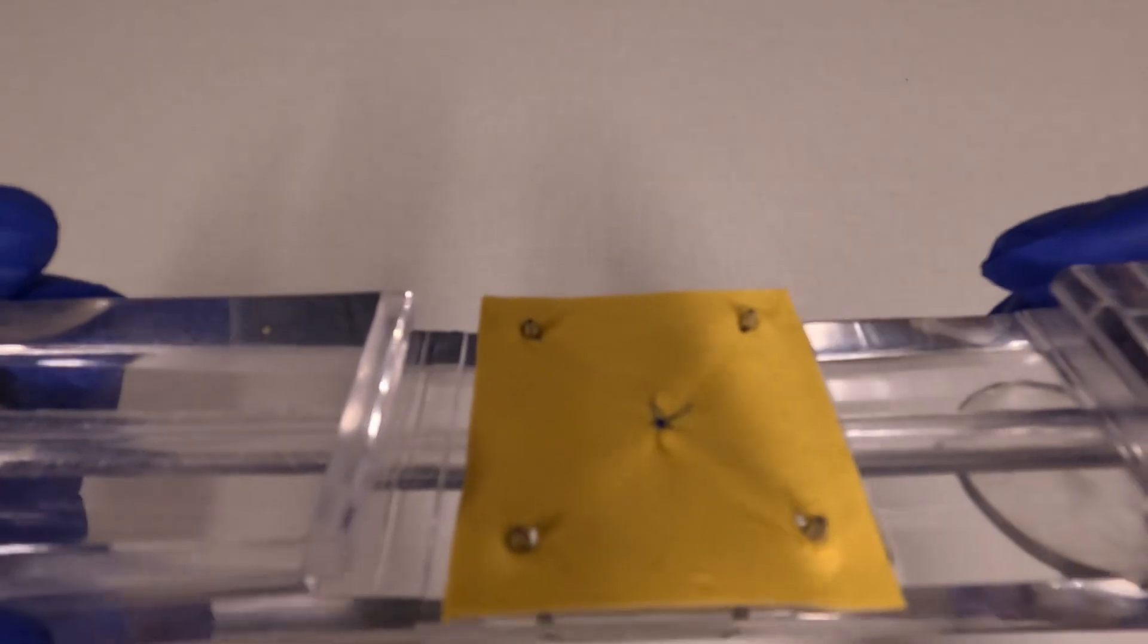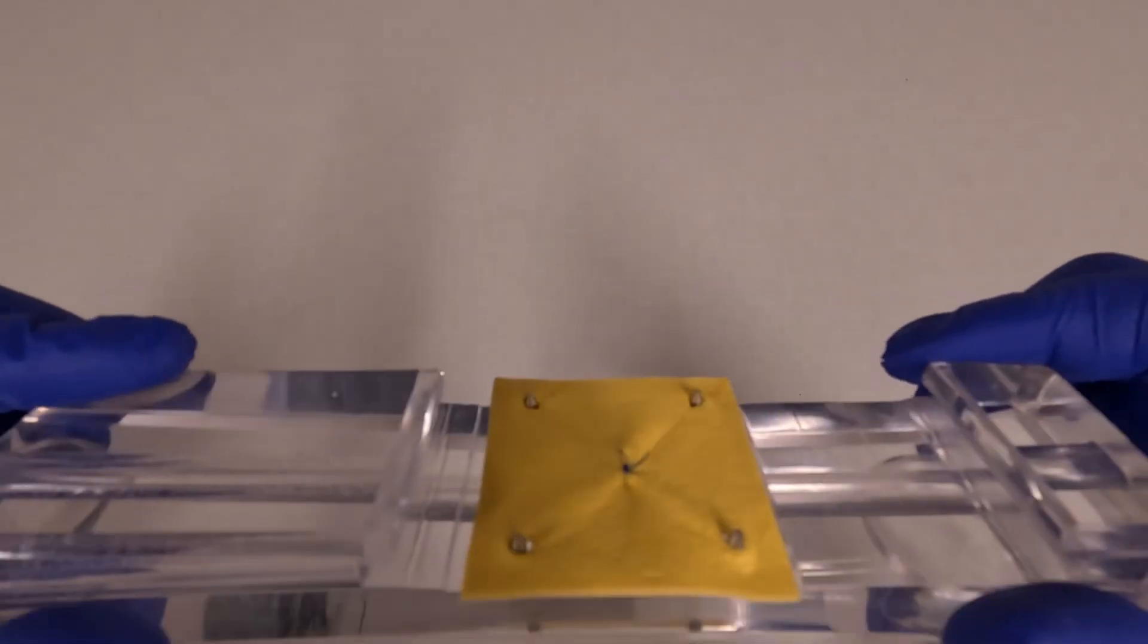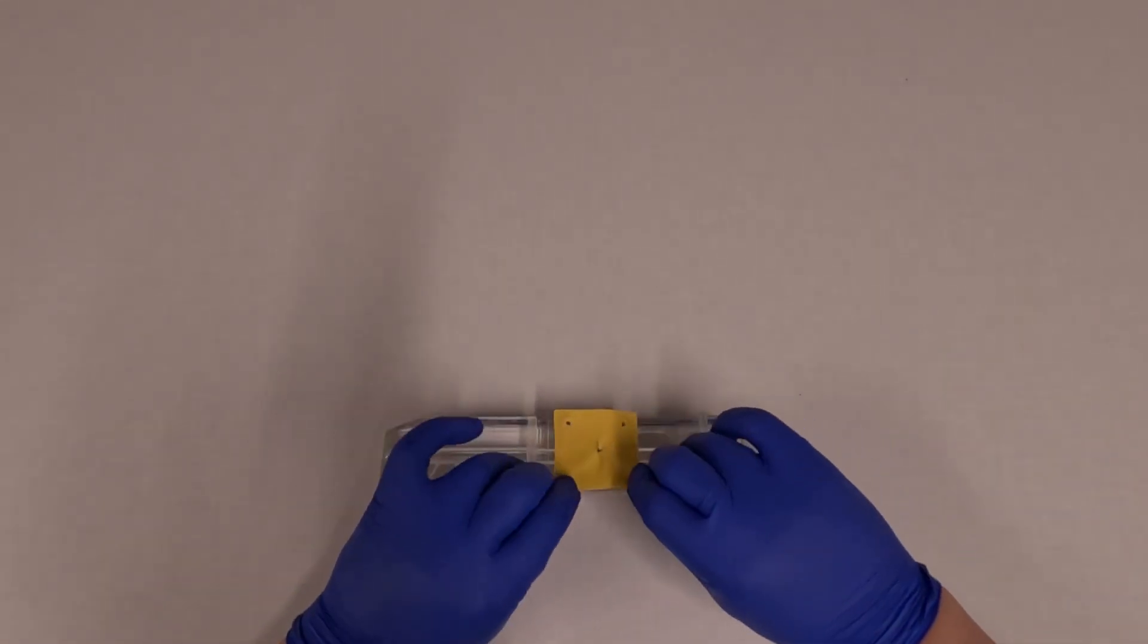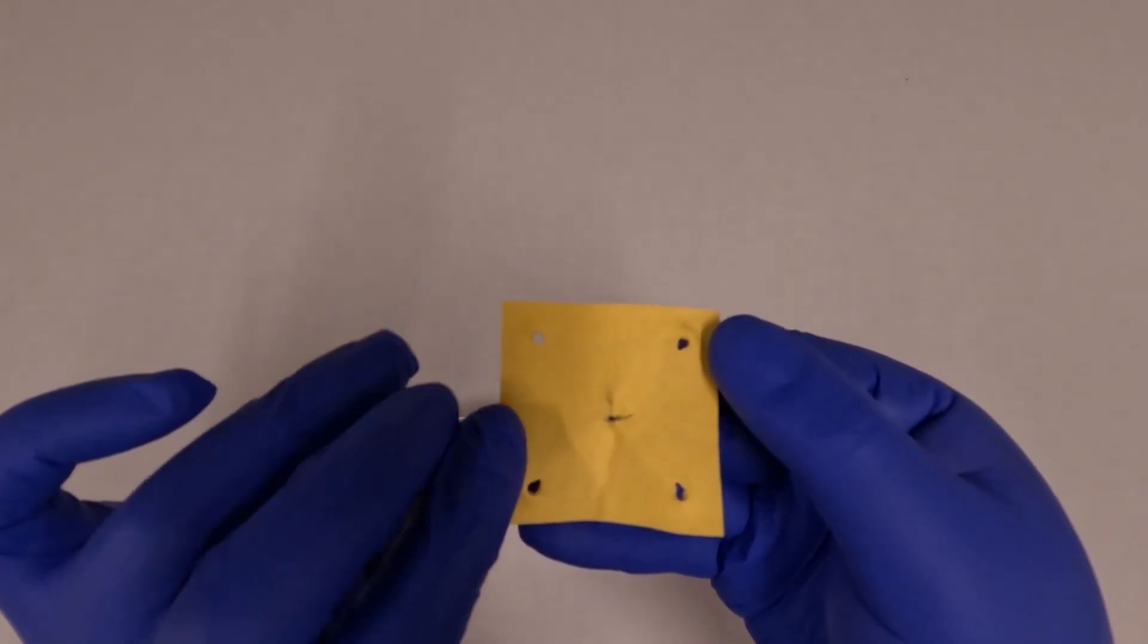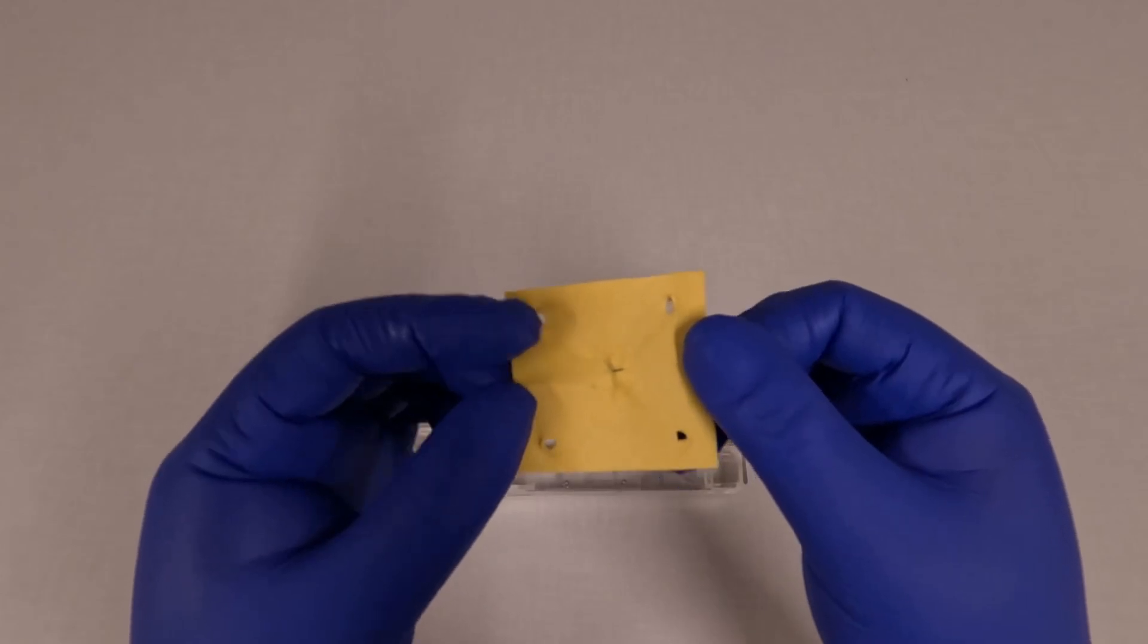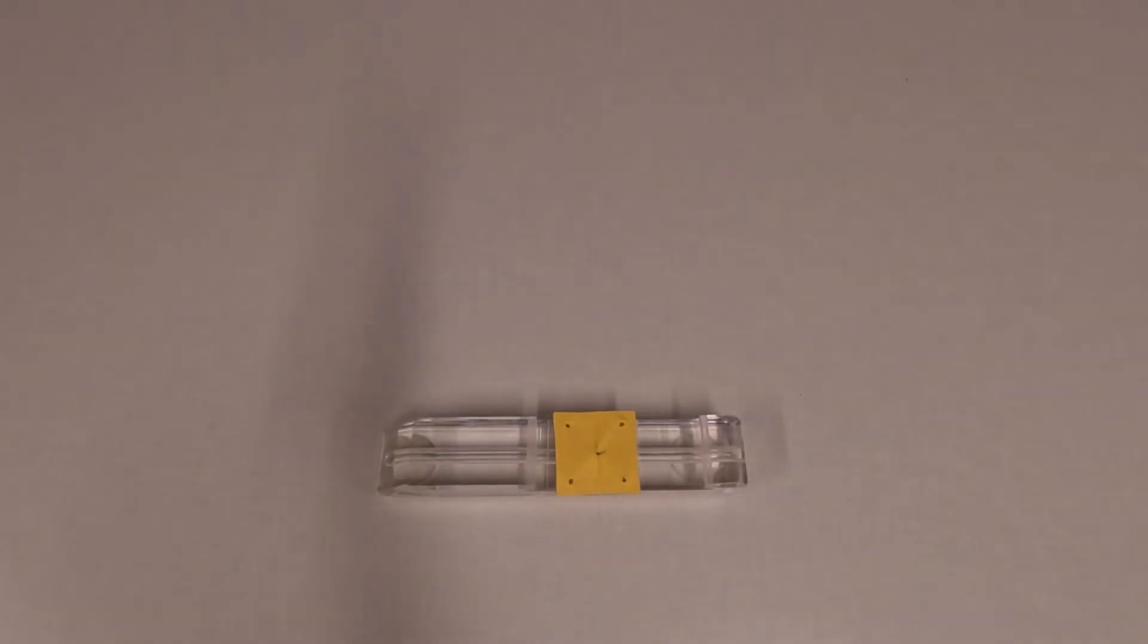You can see the suture at the site of the arteriotomy, and then if you were to look from the inside, this is the suture on top, and you have just the single throw of a suture on the inside. Perclose has a lot of clinical utility, and I strongly encourage you to learn how to use it.